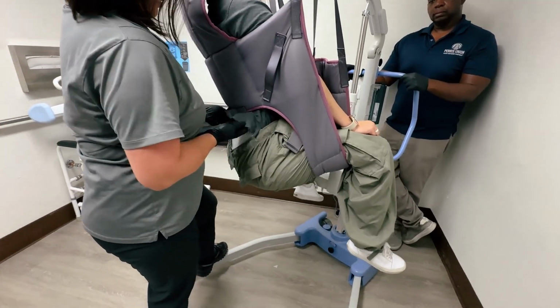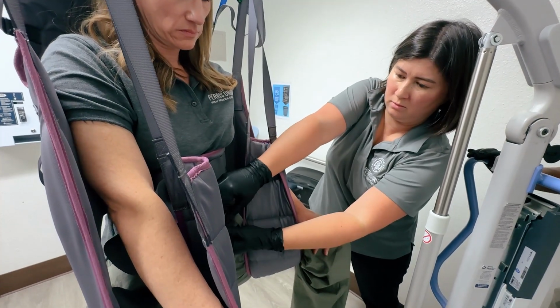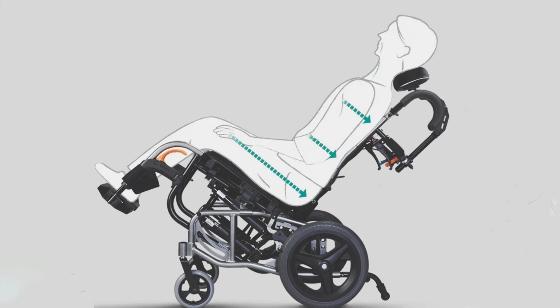Gently pull gathered pant clothing up and backwards. Zip or fasten the front portion of their clothing. If the student's wheelchair is able to tilt backwards, tilt the chair slightly backwards. This will allow the student to be positioned as far back in the seat as possible when lowered into the wheelchair.